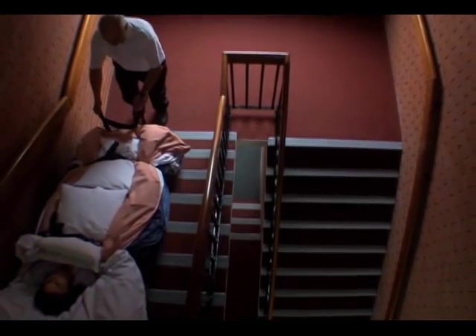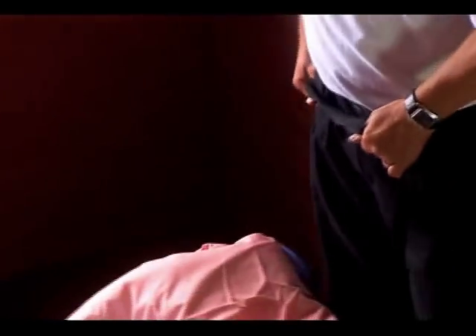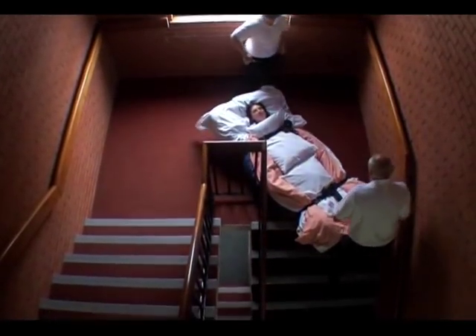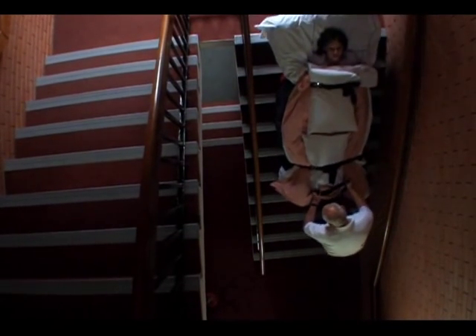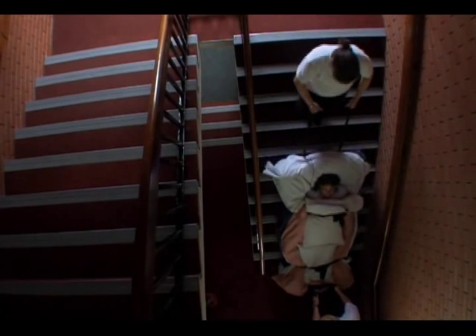When manoeuvring around a corner, depending upon the width of the landing, it is usually necessary for the person at the bottom to take the mattress end to each of the walls to allow for the full length to be moved without tipping the patient or resident. Ensure that the person remains in control at the bottom end and does not move too quickly on the staircase, otherwise there may be a risk that the person holding the top strap is unable to keep pace with the descent. When you have reached the point of safety, loosen the cross straps.